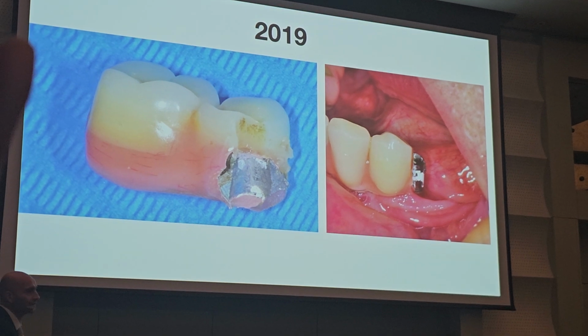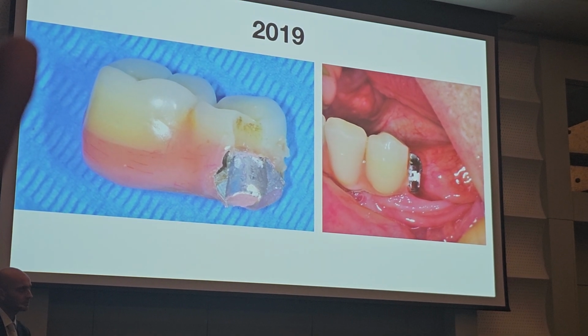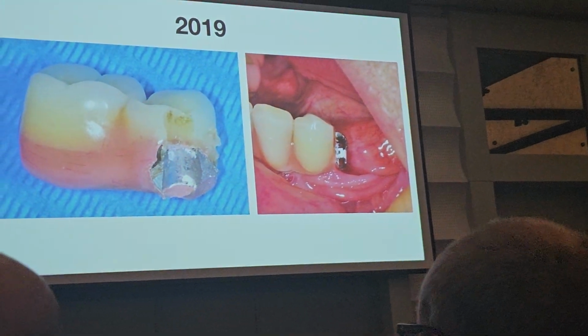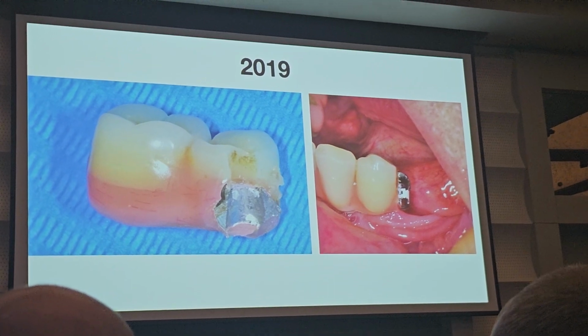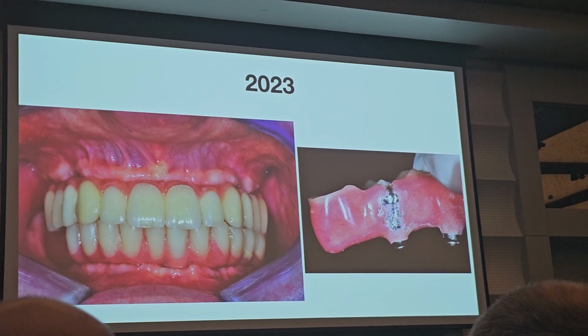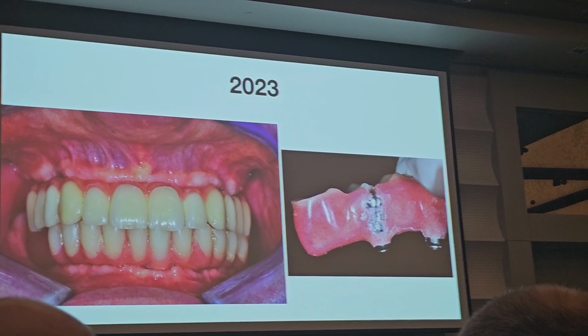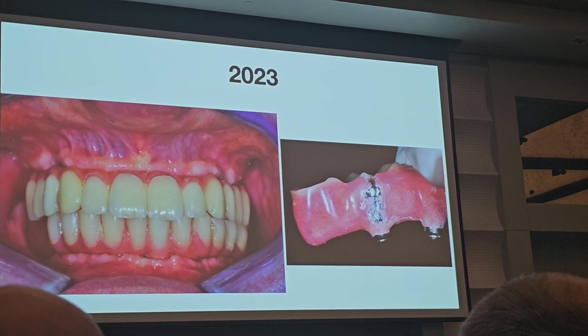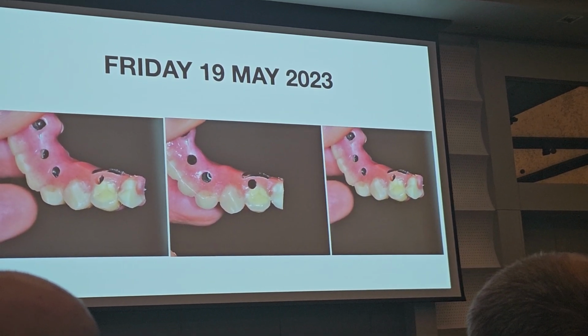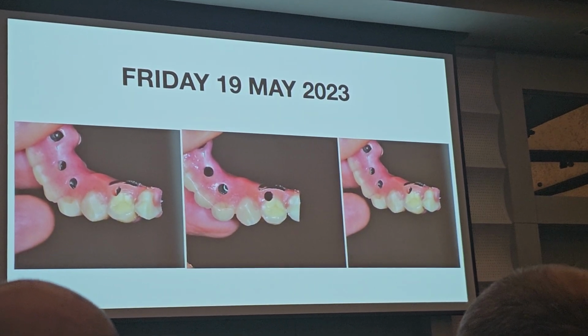Anyway, this patient starts bad, despite I planned everything honestly, amazingly. I can't compare anything, but still that technician ruined my life. First, 2019, first fracture. Look how thin is the metal framework, 0.5 millimeter on an extension. Then another fracture. So he repaired the work, but then it fractured again. So I asked him to do a better repair.